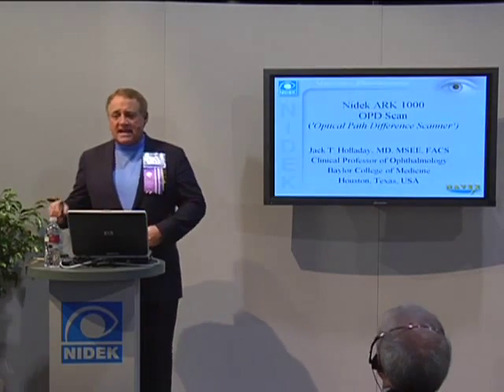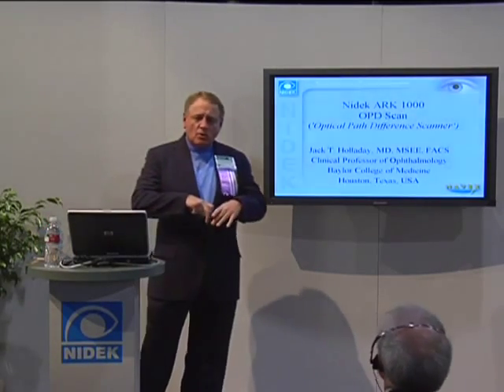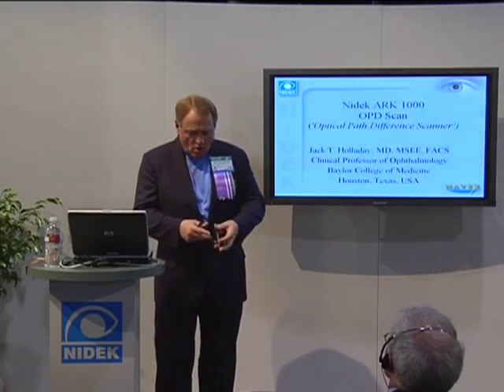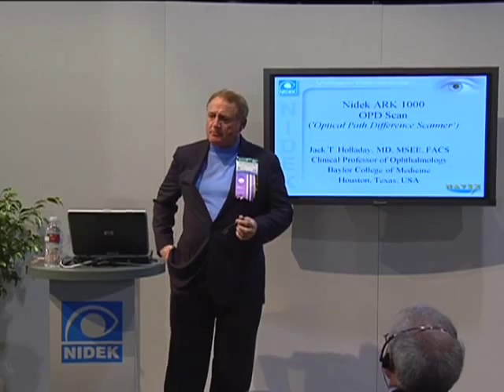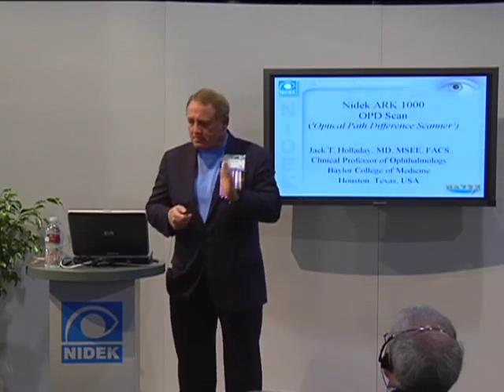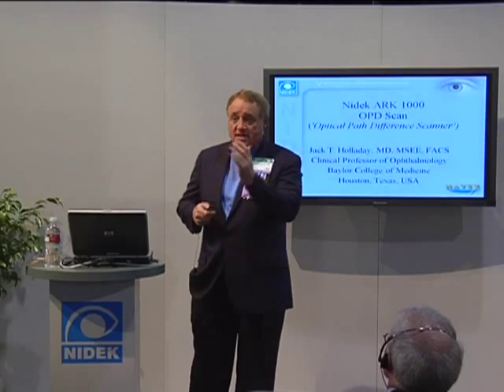Now, when you look at this, here's the thing. The OPD scan is what we would call today a wavefront analyzer, but the wavefront measurements that are taken are not like a Hartmann-Shack or like a Tscherning aberrometer. It's an aberrometer that we'll see uses the same principle that's used for retinoscopy, and that is it looks at the scan of a slit being moved across the eye.